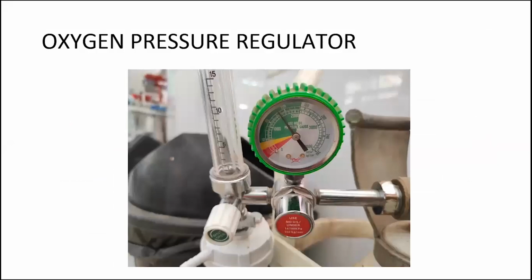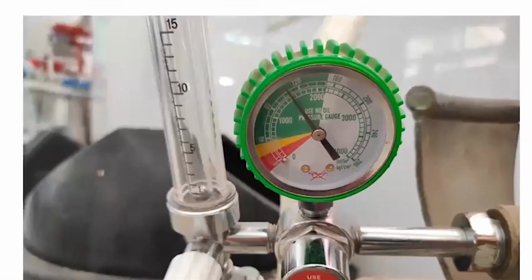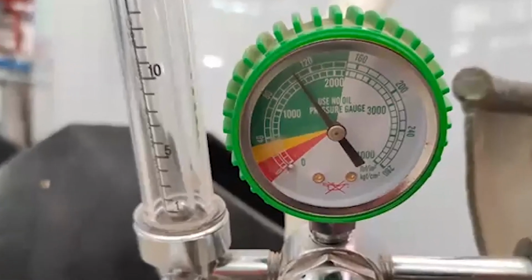Oxygen cylinders contain oxygen under pressure, and the pressure gauge displays the level, which gradually falls as the cylinder is depleted. When the valve is turned on, the full pressure is typically about 2200 psi, that is pounds per square inch, even though the size and subsequent capacity of the tank may vary. This is shown by the green section as shown in the picture. When the needle gets to the lower part of the red section on the gauge, it means it is time to change the cylinder, that is around 200 psi.